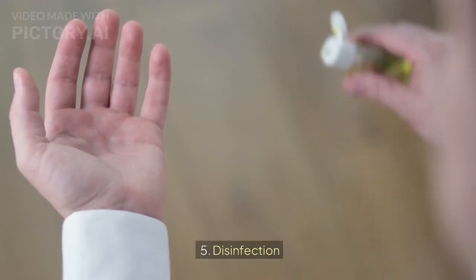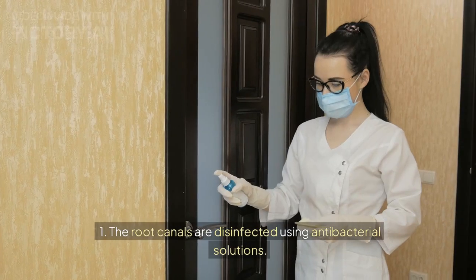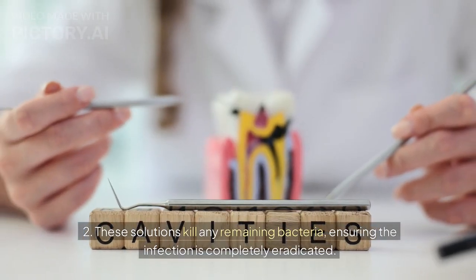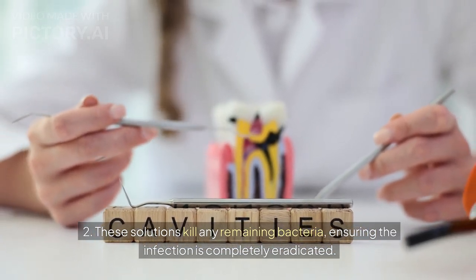5. Disinfection. Cleaning with antibacterial solutions. The root canals are disinfected using antibacterial solutions. These solutions kill any remaining bacteria, ensuring the infection is completely eradicated.